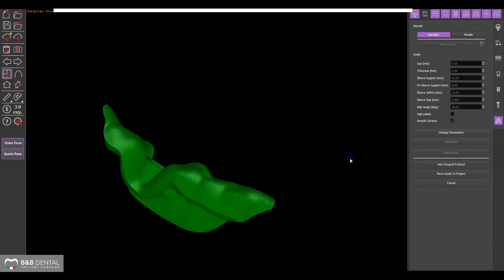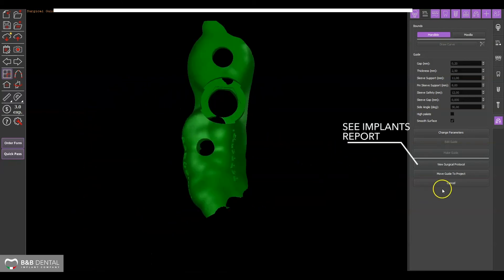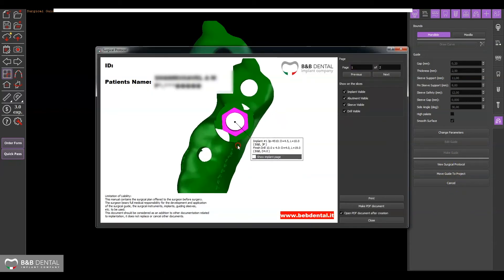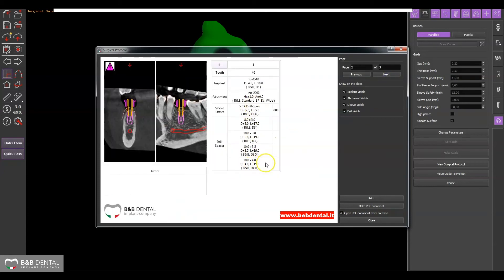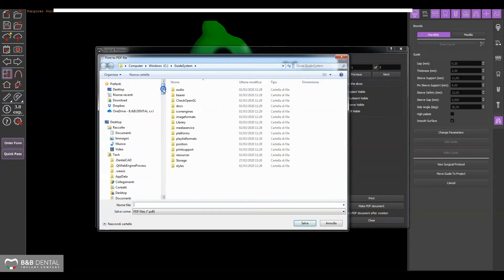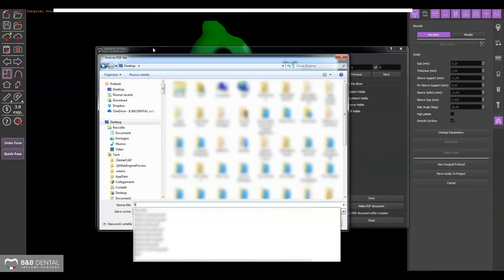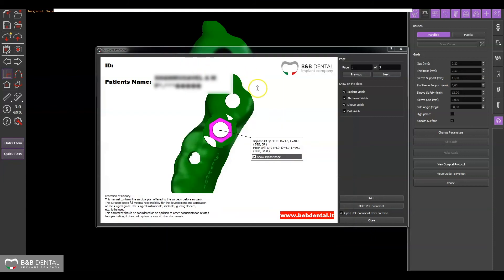Clicking on the View Surgical Protocol button will activate a window, giving you all the indications contained in a clearly written report. By flagging the Show Implant page option on this window, you can add all the pages relating to the implants, including the final drills to be used for the correct insertion of that implant and the information relating to the position of the sleeve.